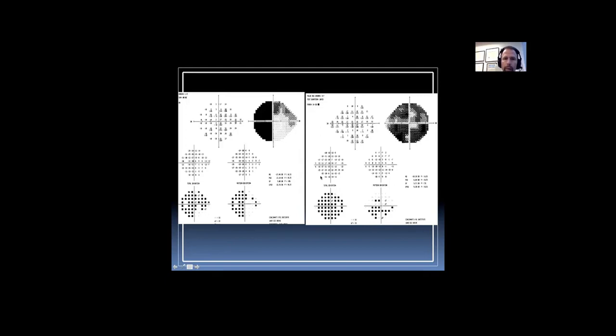What should we look for when neurologists send an idiopathic intracranial hypertension patient? The most common field defect, of course, is a big blind spot. I don't really consider that much. It's not an optic nerve problem. It shows that there's swelling of the nerve, so certainly you're going to look for big blind spots, but that does not mean there's any optic nerve dysfunction. Remember, the reason there's a big blind spot is that the retina is being pushed aside.